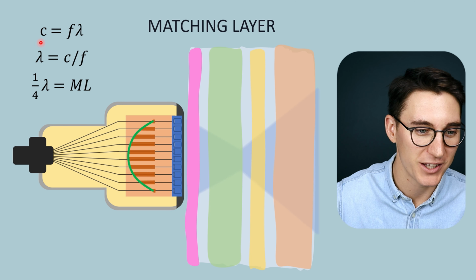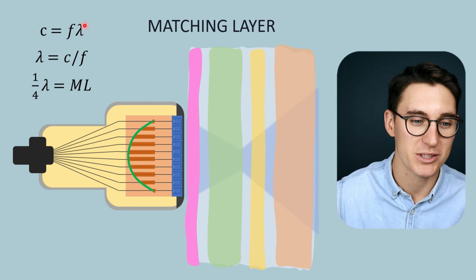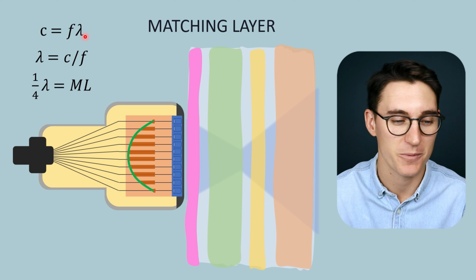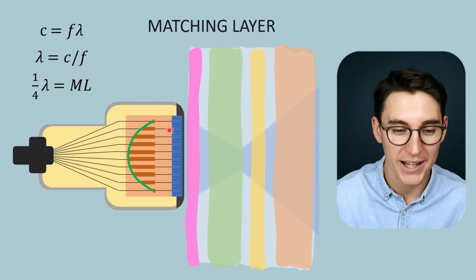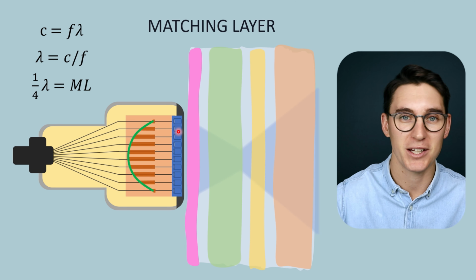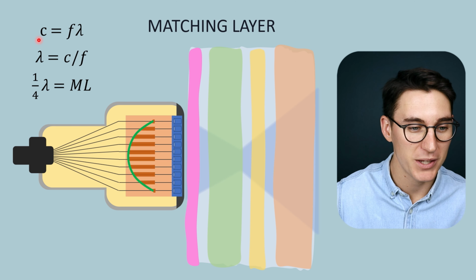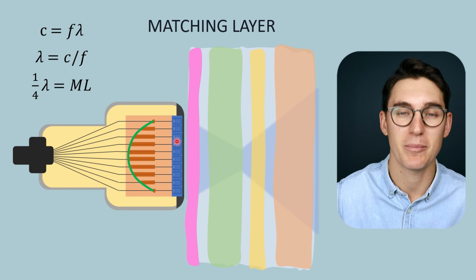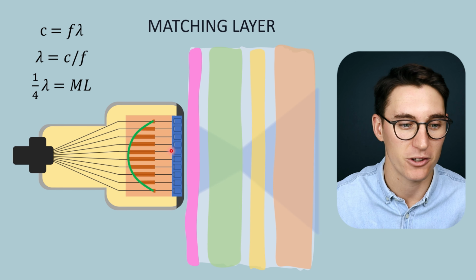Now, we can calculate the ideal thickness of this matching layer by using this formula again. This is the exact formula that we just looked at, and we saw that the speed of sound is equal to the frequency times the wavelength of that sound. Now, we've seen that the frequency has been set by our piezoelectric material, dependent on the thickness of that material and the speed at which sound travels through that material. We will also know the speed of sound traveling through the matching layer.